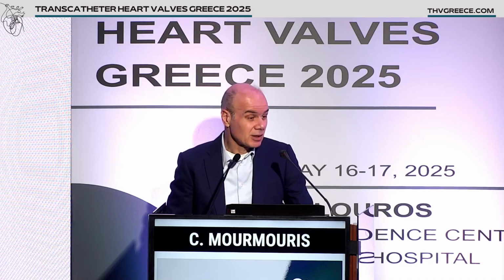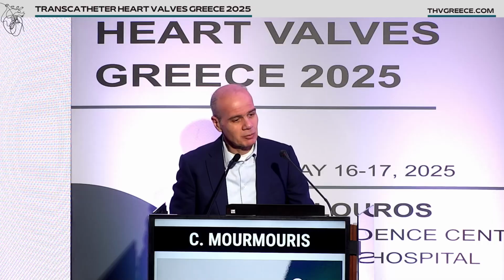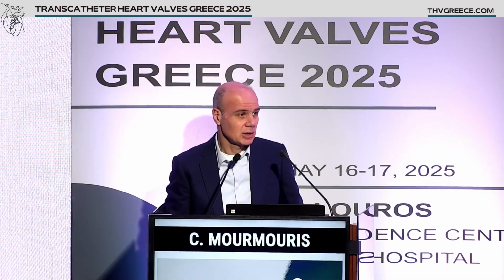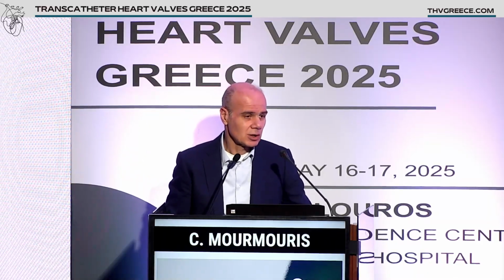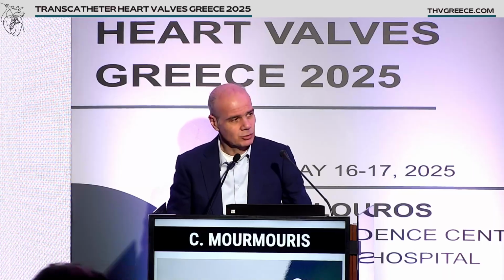But another issue is that using photon counting CT, we can use less contrast medium, which is very important in these cases, because often patients have renal function problems.